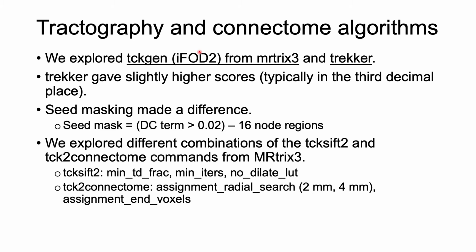constraints. For tractography, we used the iFOD2 algorithm in the tckgen tool from MRtrix and separately Trekker. Trekker gave slightly higher scores. Seed masking did make a difference. We defined seed masking as the DC term of the FOD being bigger than 0.02 without the node regions.